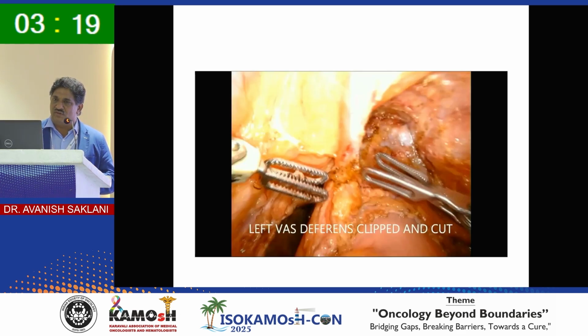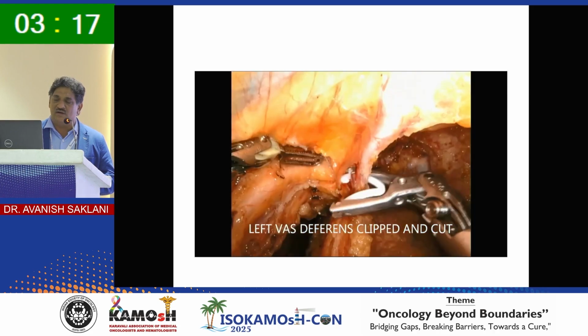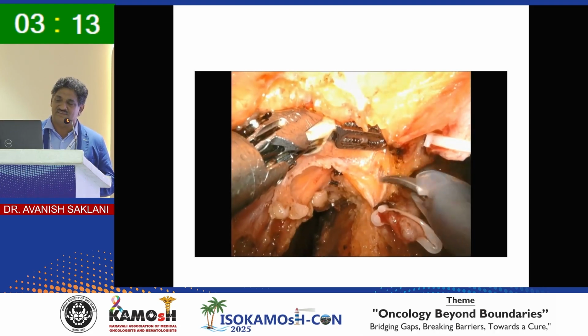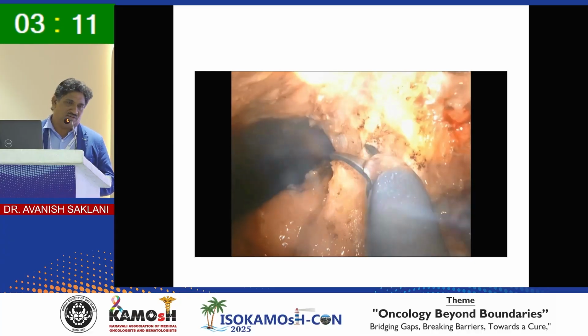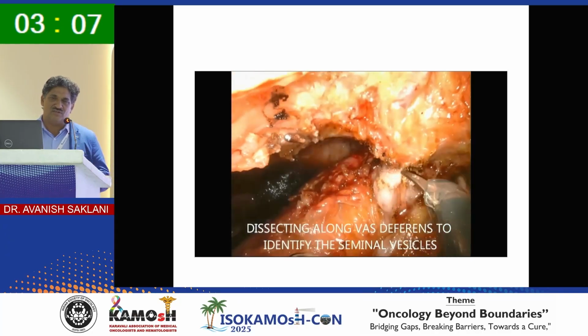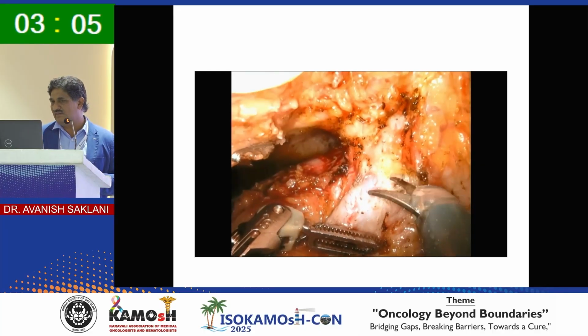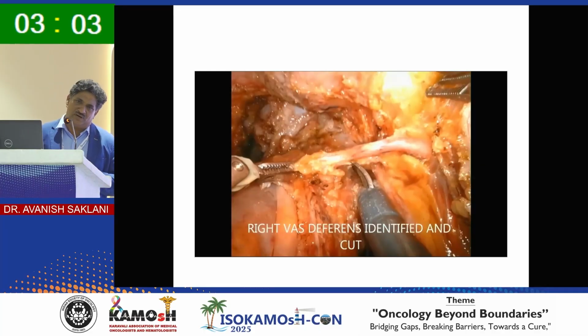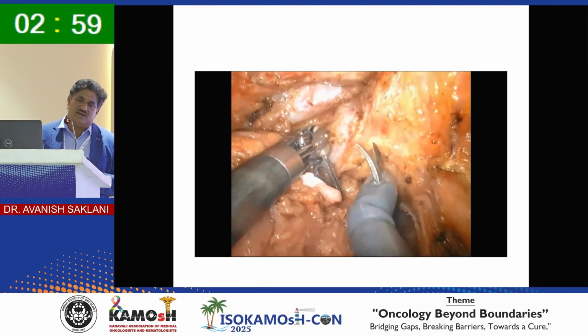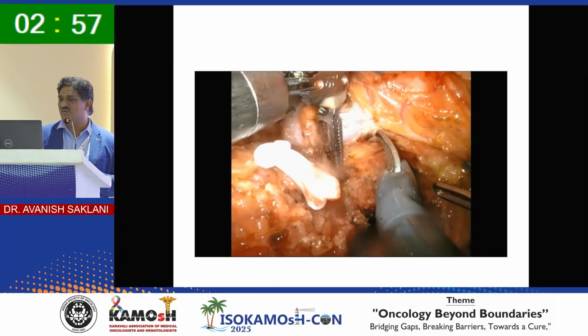So the other option, if you have a T2 cancer, is something like if you want to do an intersphincteric resection. This is an extended intersphincteric resection, where you dissect down to the pelvic floor. For T2, you have not given radiation. This is the one after radiation. I don't have a shorter clip than this. So you can dissect down to the pelvic floor, dissect in the intersphincteric space, and then you get the colon out and do a hand-sewn anastomosis.